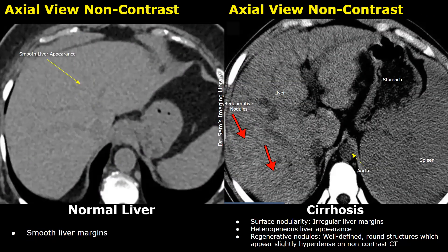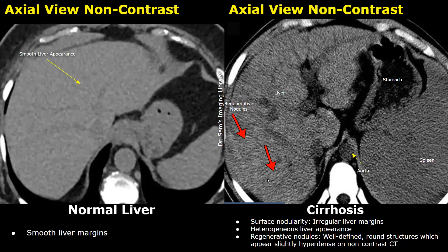These are non-contrast images. In the left image the liver has a smooth appearance and there is no surface nodularity. In the image on the right there is surface nodularity and the liver has a heterogeneous appearance. Regenerative nodules can be seen in cirrhosis cases — they are more easily seen on a plain CT. They appear as well-defined round structures which may appear slightly hyperdense on a non-contrast CT. You can see many small rounded structures inside the liver, and the spleen is also enlarged.